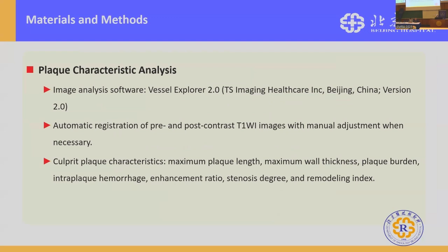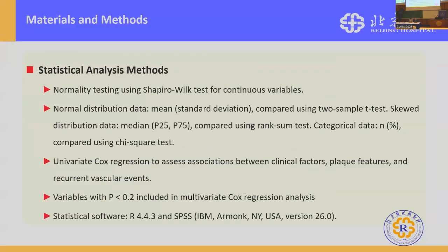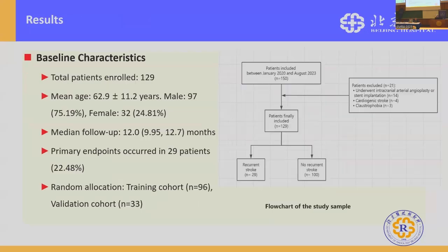Plaque characteristics were manually evaluated using the Vessel Explorer software. Here are the statistical methods we employed. We recruited 129 patients. During a median 12-month follow-up, 29 endpoint events occurred.